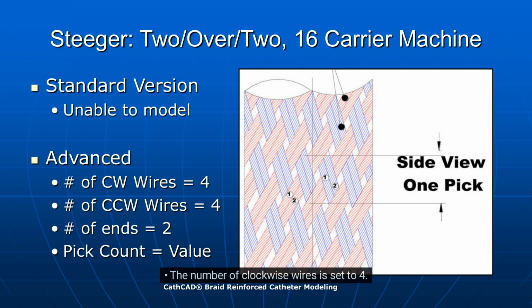The number of clockwise wires is set to 4. The number of counterclockwise wires is set to 4. The number of ends is set to 2. The pick count entered should be that of the desired value.